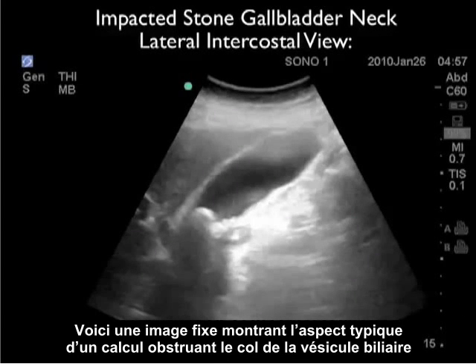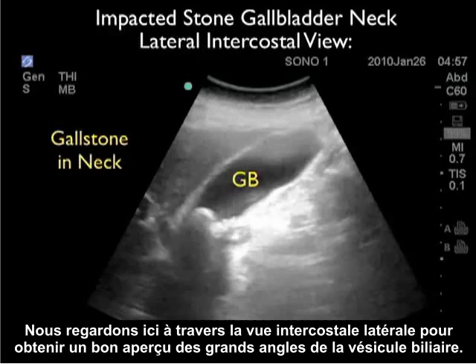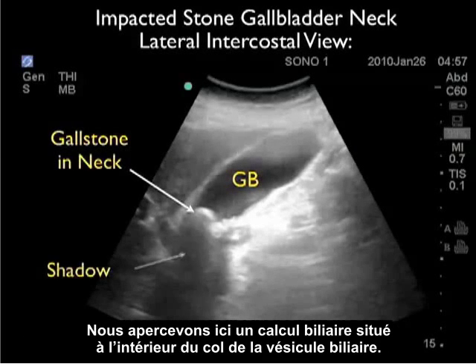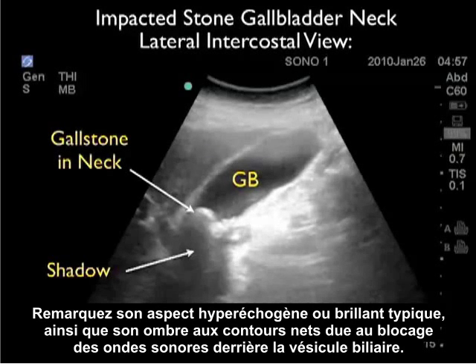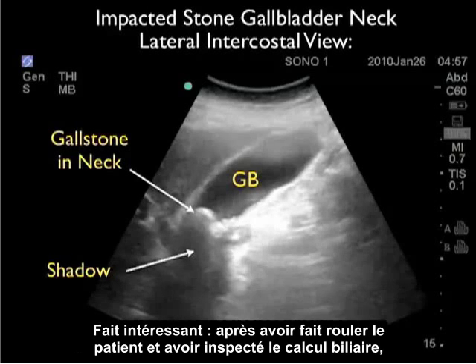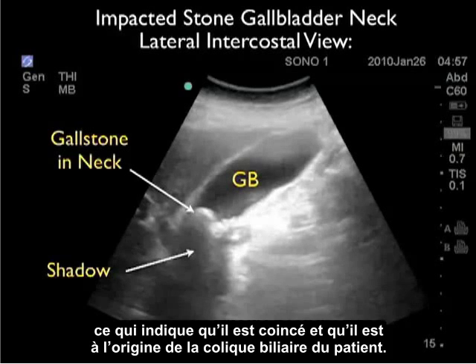Here's a still image showing the classic appearance of an impacted stone at the gallbladder neck. We're looking through the lateral intercostal view, giving a nice long axis view of the gallbladder. We can see a gallstone located within the neck of the gallbladder with the classic bright or hyperechoic appearance, and we see the hard shadow — the blackout of sound waves posterior to the gallstone. Interestingly, as we rolled the patient around and inspected the gallstone, it failed to move, confirming it was impacted and the cause of the patient's biliary colic.